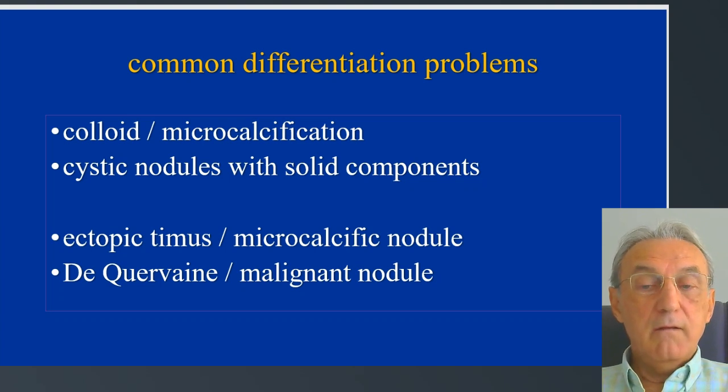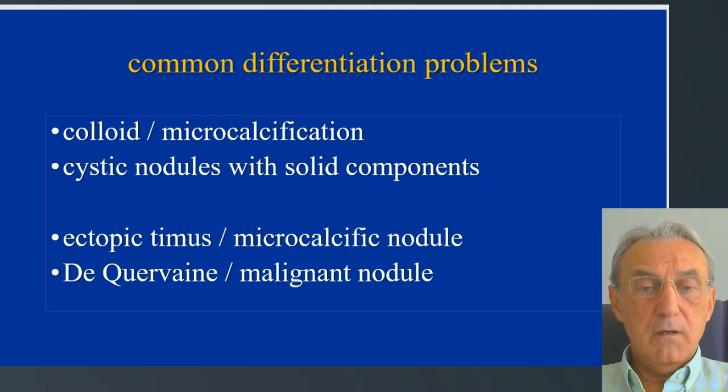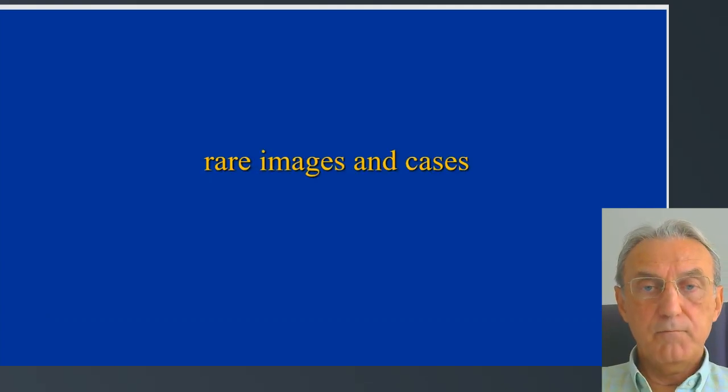And in acute or subacute thyroiditis, the hypoechoic areas may be misdiagnosed as malignant nodules, but we should be careful and follow up because sometimes the two events may coincidentally be seen in the same patient.